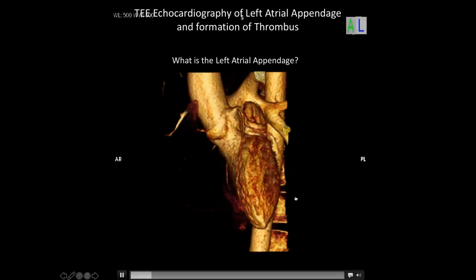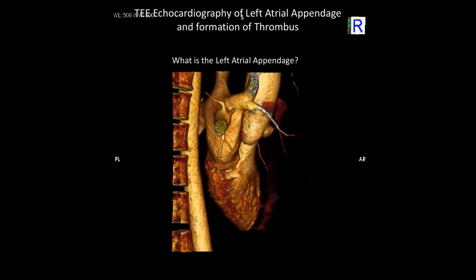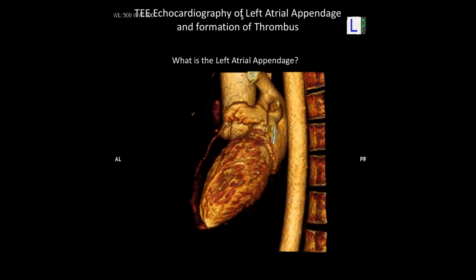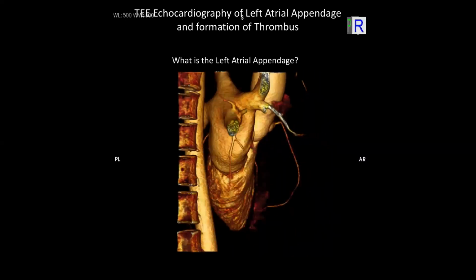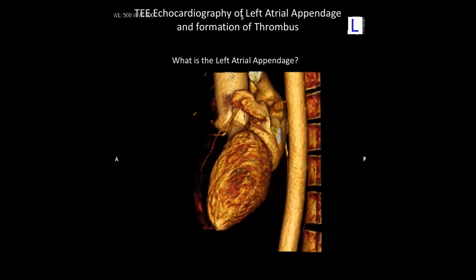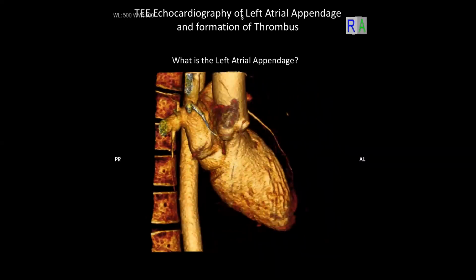This CT, interestingly enough, comes from a Siemens, and it probably took 3 heartbeats to make this movie, because their detector array is not the super wide one. It's about, I want to say, 6 centimeters. So they have to start at the top and raster down through the heart. It takes a couple of beats, and then when you put them together, you get this. It looks like that person had the same beat every time, because I don't see any seams or stitching. It looks pretty good.